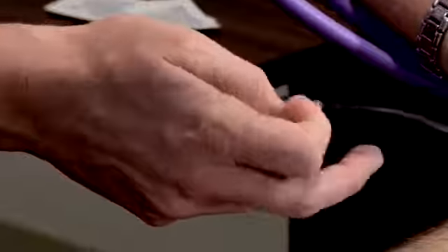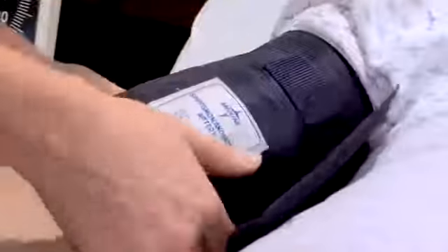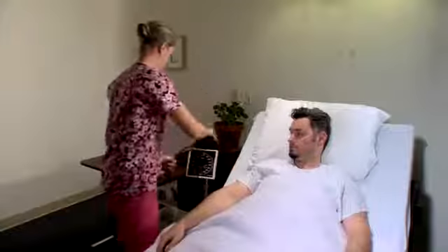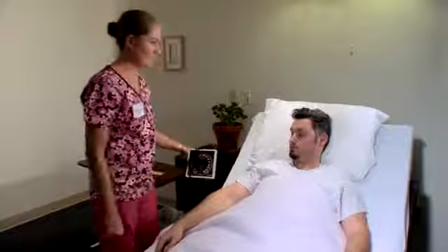Your blood pressure is 112 over 66. I'm going to lift up your arm. Do you need anything else before I go? I'm good. Okay, thanks.